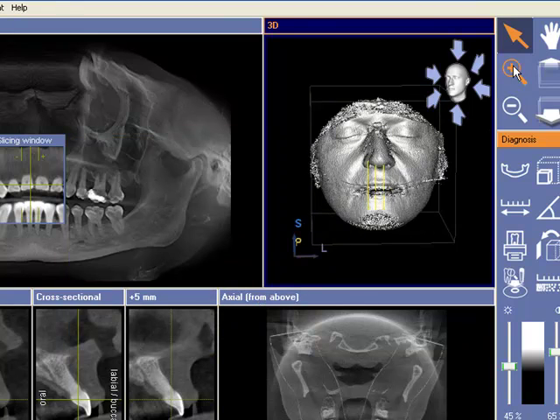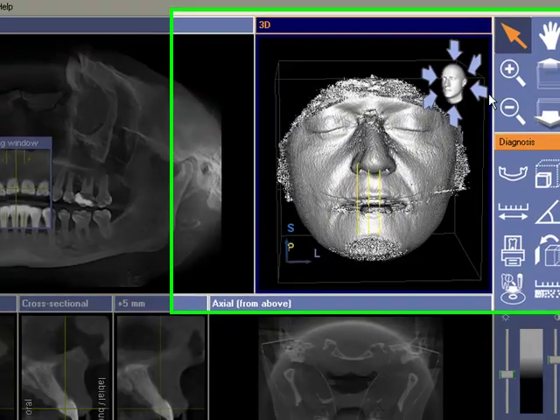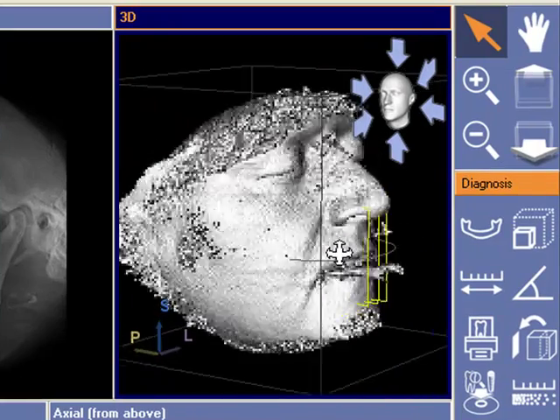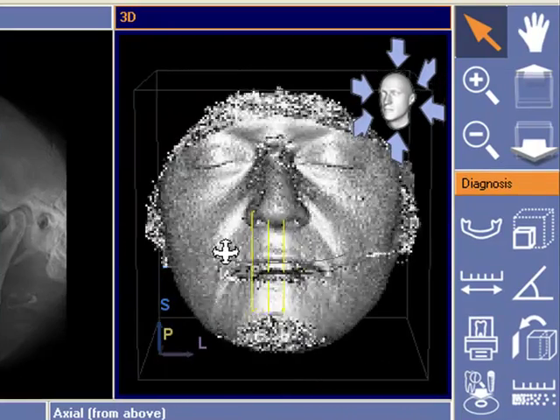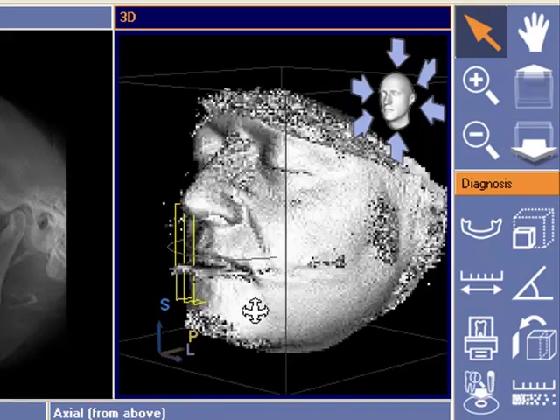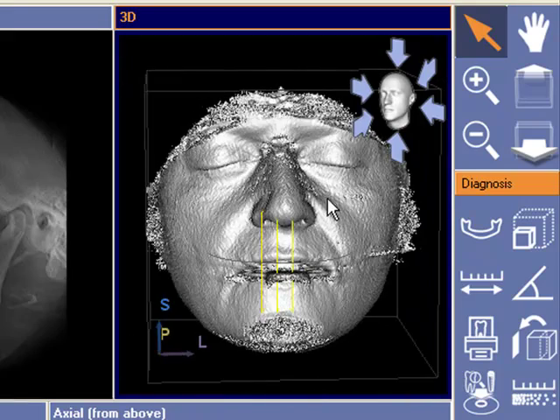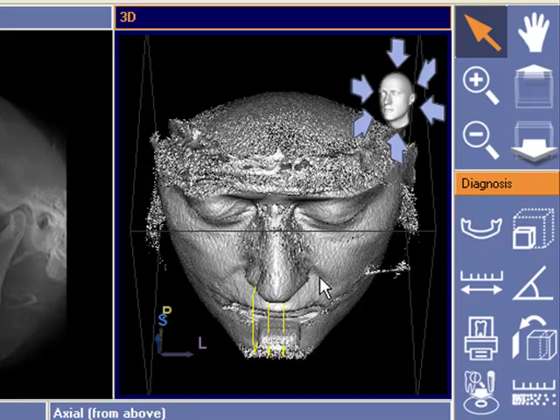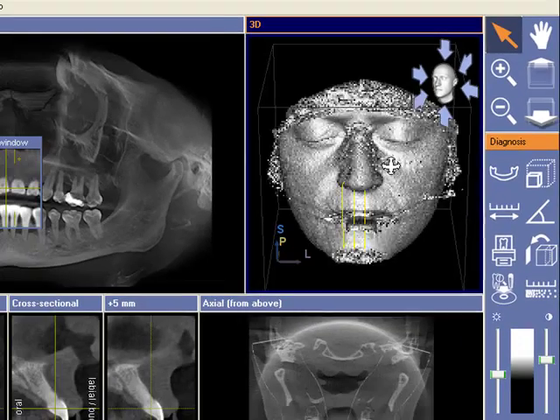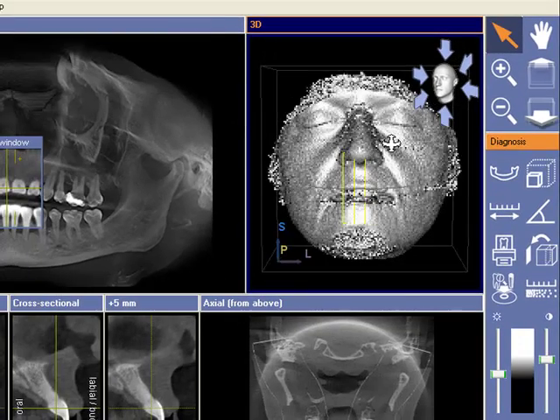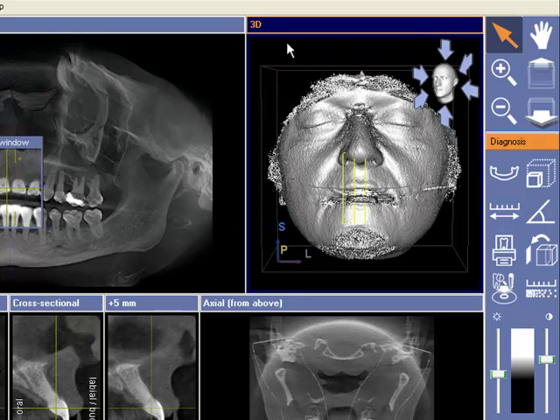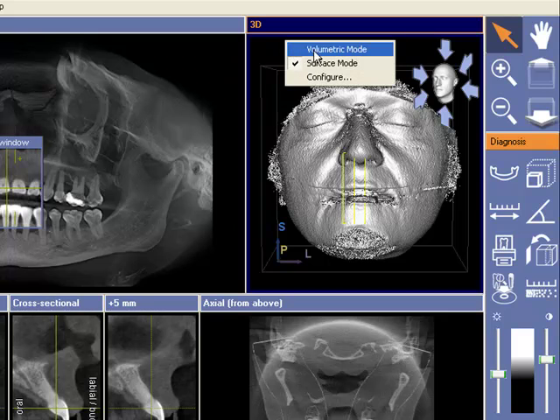Now you can see we've got a nice image of the patient that's been scanned. You can rotate that at any angle. And when you're ready to go back to volumetric mode, just right mouse click anywhere in the area and click left mouse button on volumetric mode.